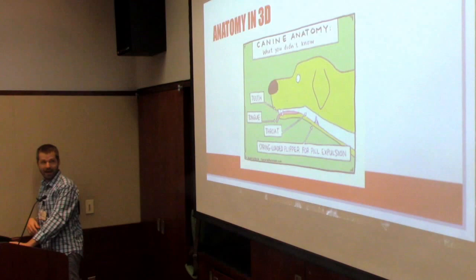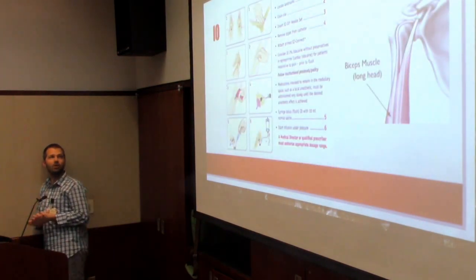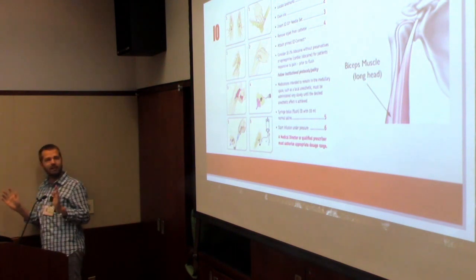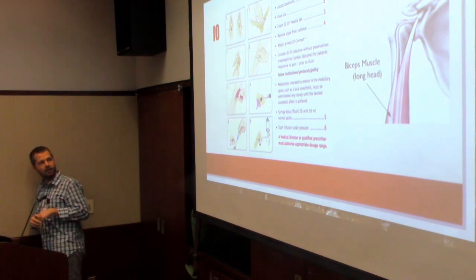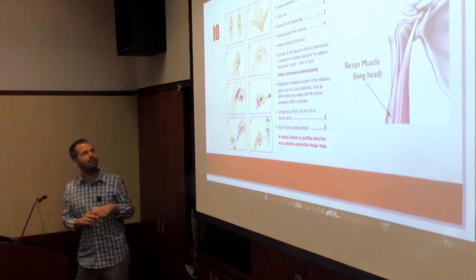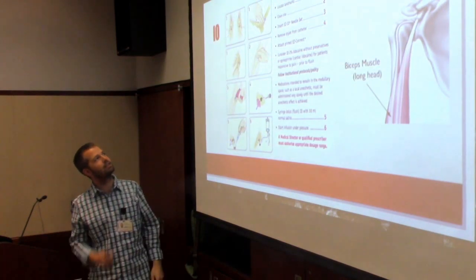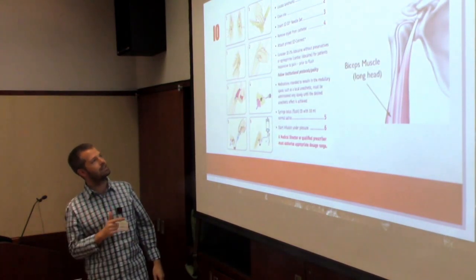So now let's talk about anatomy. Not every single anatomical point in the world. There's, I think, 6 acceptable places you can stick an IO. And you look at these pictures and you're like, okay, so it looks like they're sort of pointing towards just below the knee. It's great. If my patients are translucent, then this is going to be great for me. I can see the bone and I can just stab it.